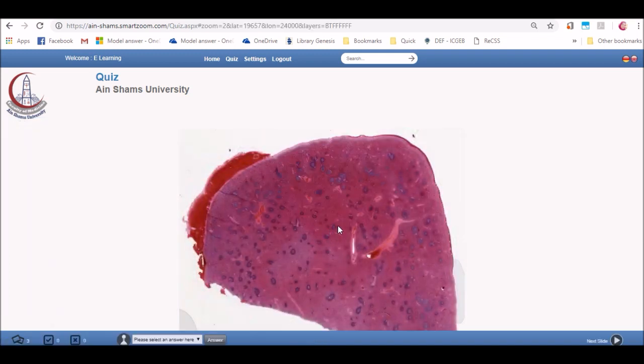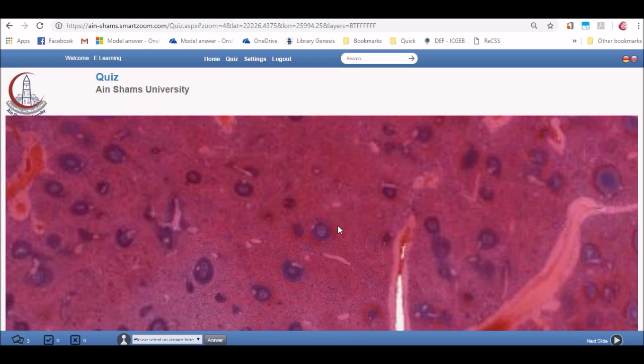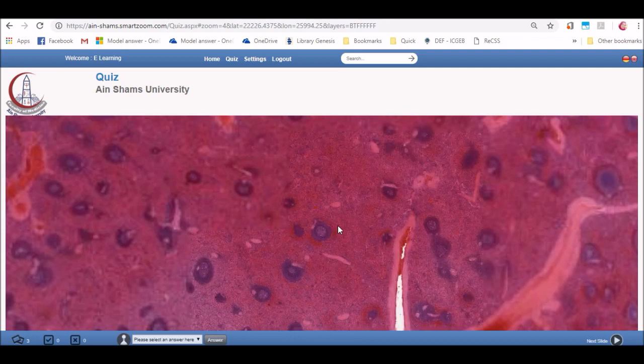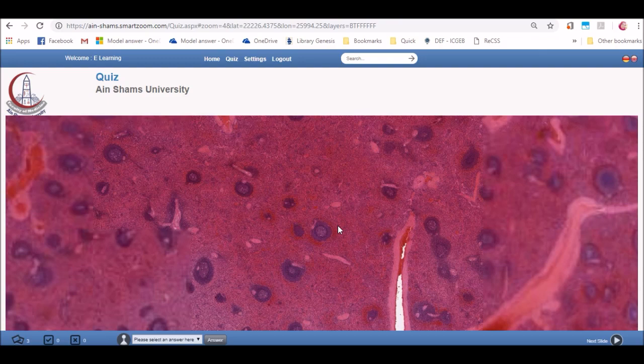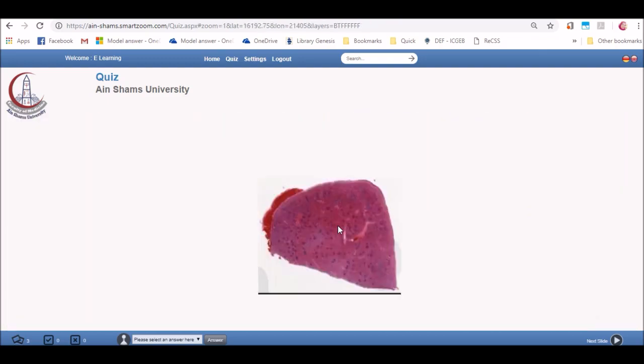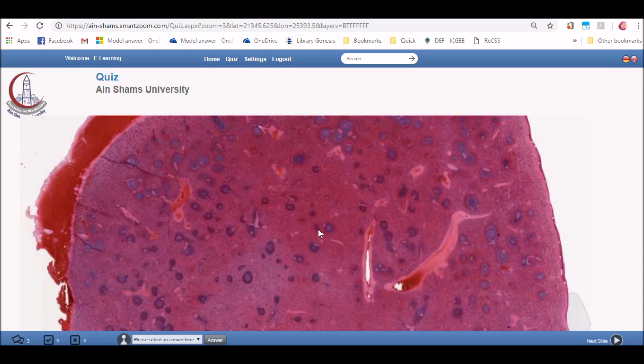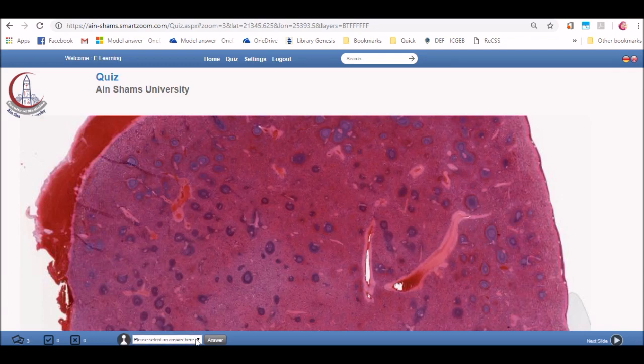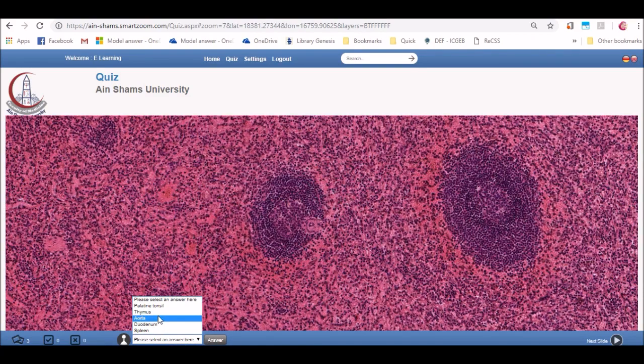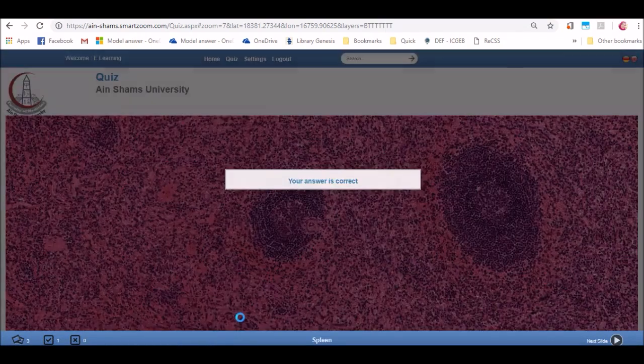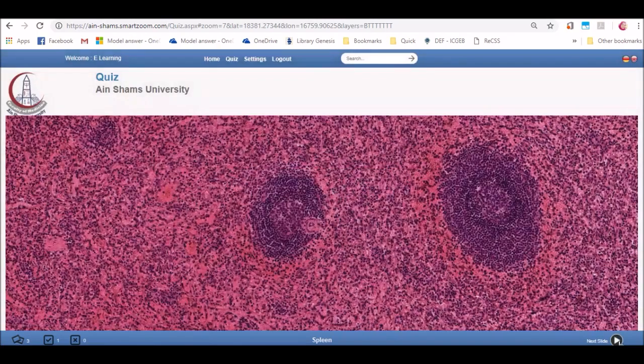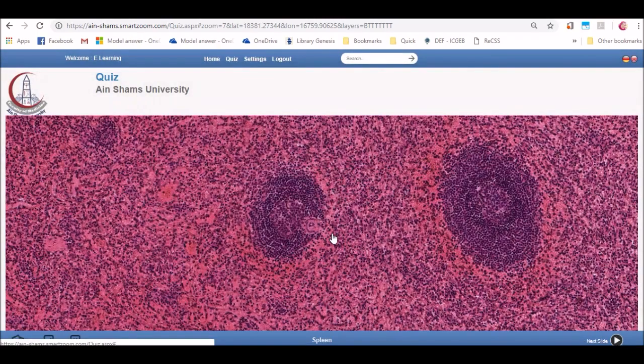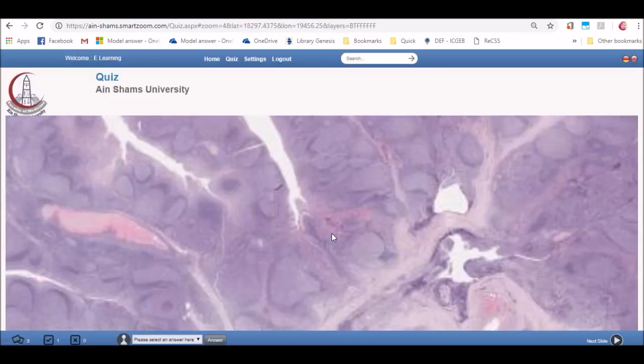The slides of the quiz will appear with no annotations or any information given. In the bottom, you will find a list of multiple choices that you can choose any of them as an answer of the identification of the given slide. Choose the identification and click on answer. Then a message will appear that states if this answer is right or wrong.